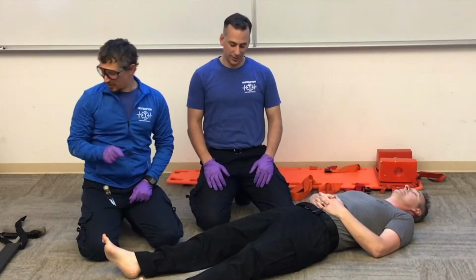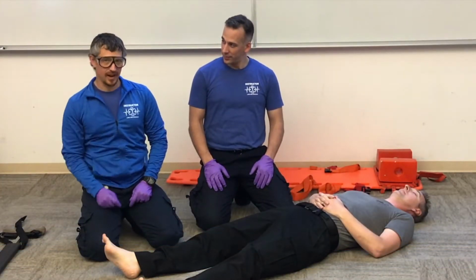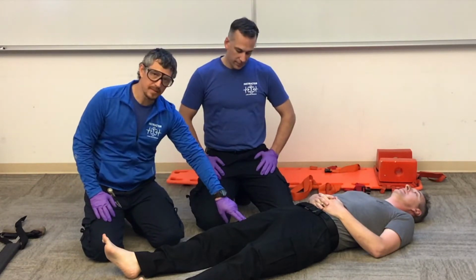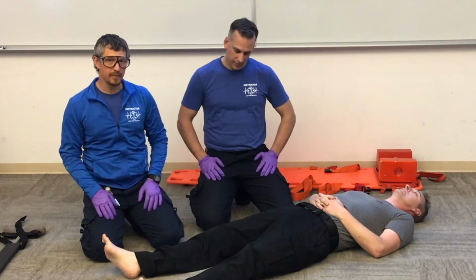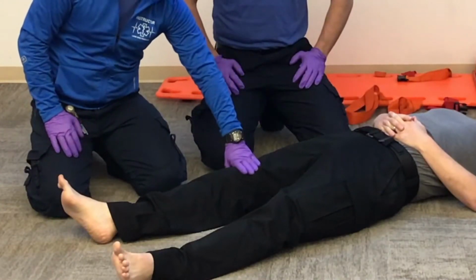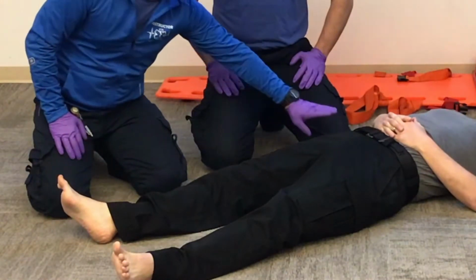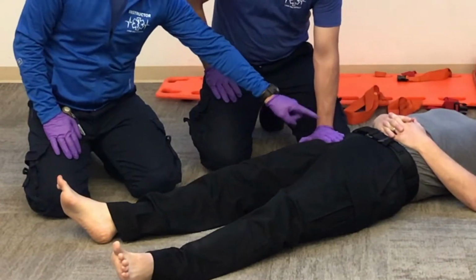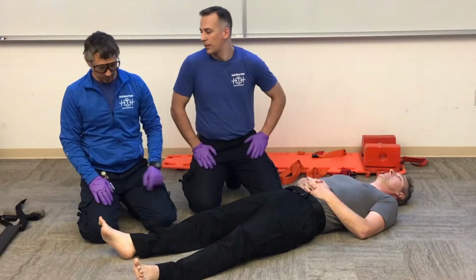And welcome back. Today we're going to look at our traction device. So our traction device is for a midshaft femur fracture. Where's a midshaft femur fracture? That's going to be on the femur, about a palm's length above the knee, and about, Nathan, can you show me a palm's width below where the femur enters the pelvis?